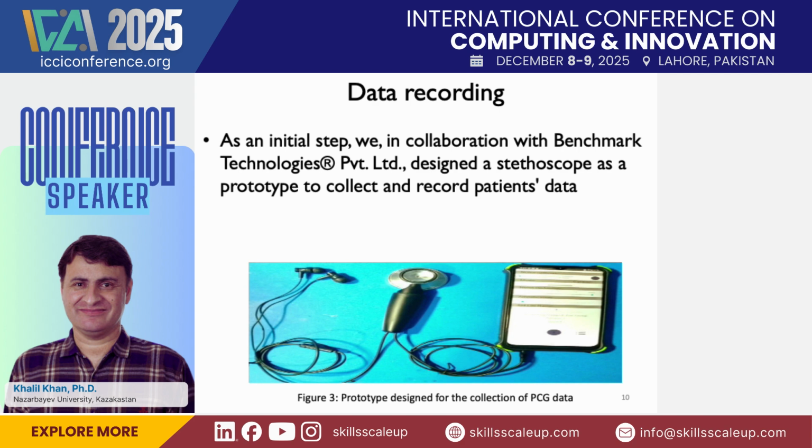So the idea is to put this stethoscope on a baby's heart and then connect it to the mobile through Bluetooth or through this wire, and then all the recording of the baby's heart will be here. So the data for the normal patient or abnormal patient will be here. Instead of taking the stethoscope which I talked about earlier, we designed our own stethoscope with this strategy.